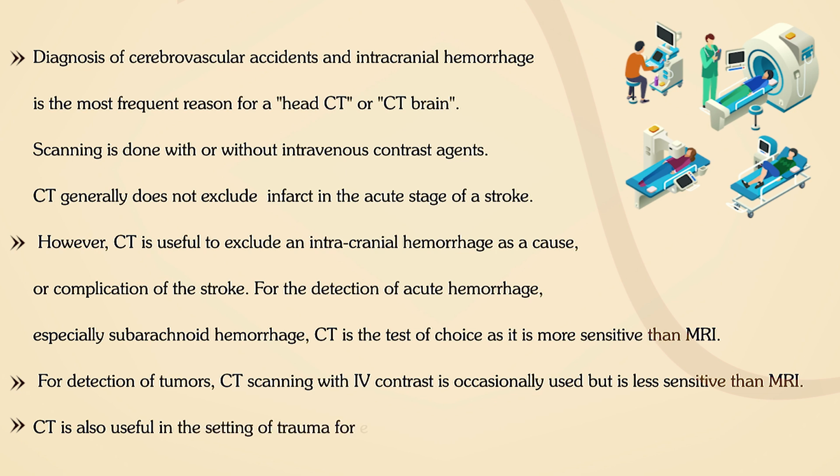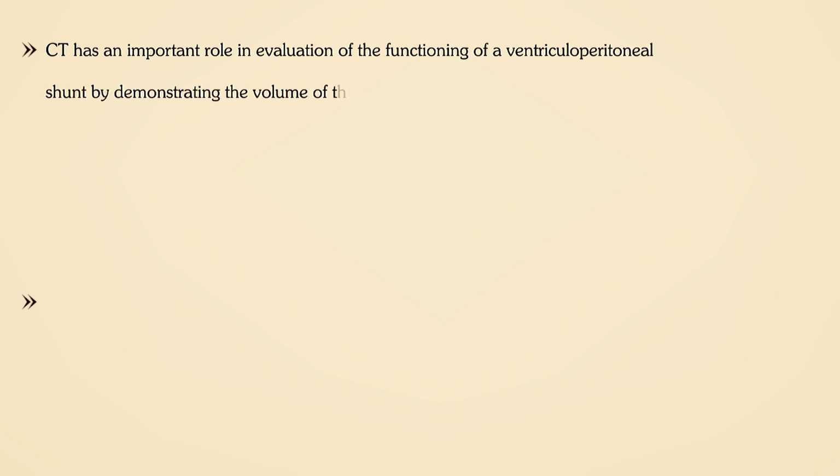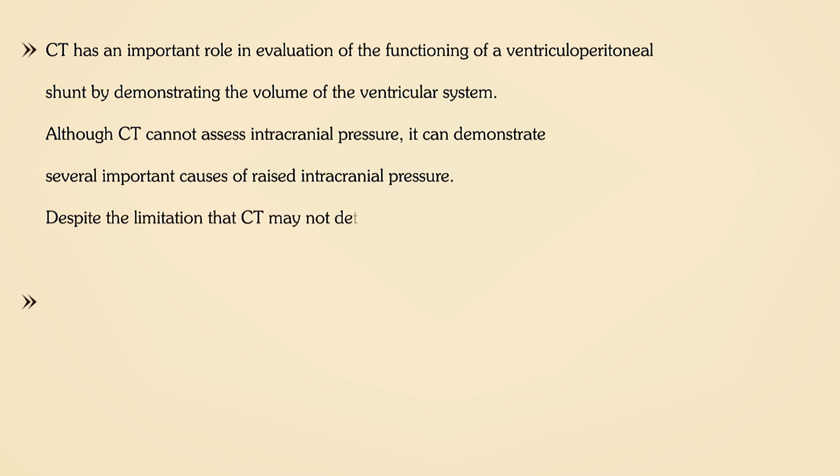CT is also useful in the setting of trauma for evaluating facial and skull fractures. CT has an important role in evaluation of the functioning of a ventriculoperitoneal shunt by demonstrating the volume of the ventricular system. Although CT cannot assess intracranial pressure, it can demonstrate several important causes of raised intracranial pressure.